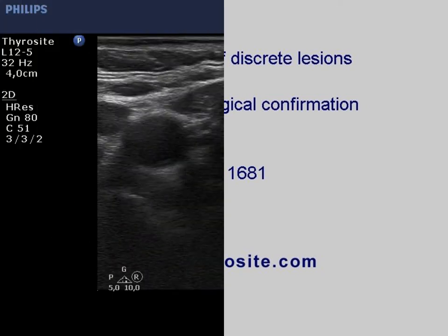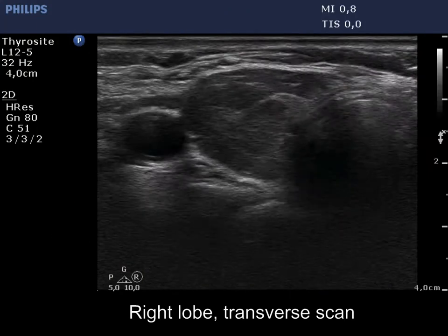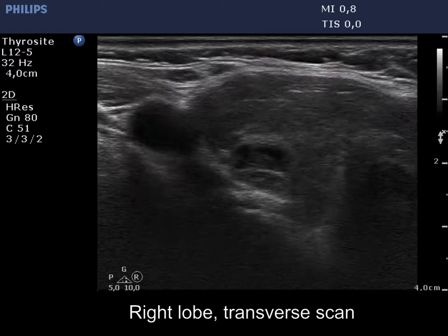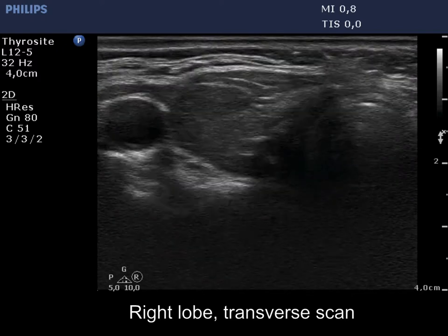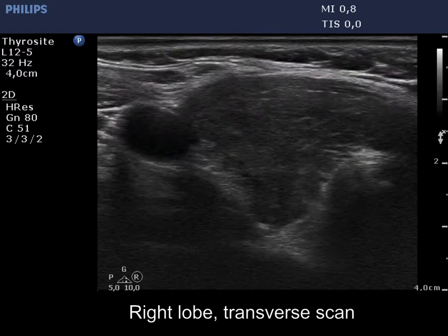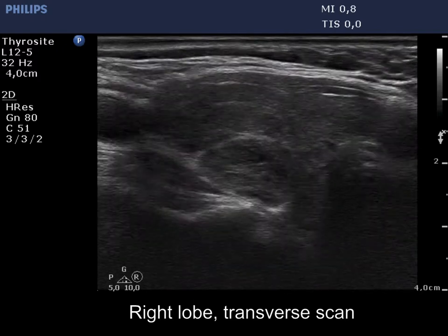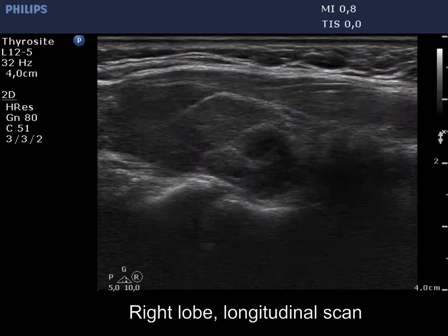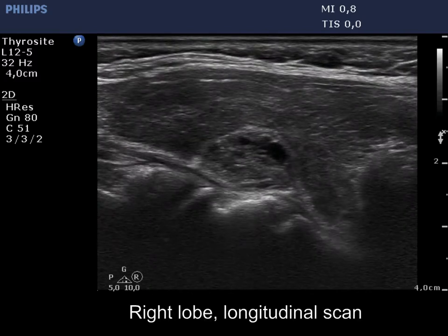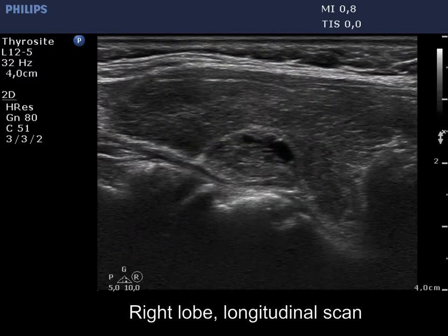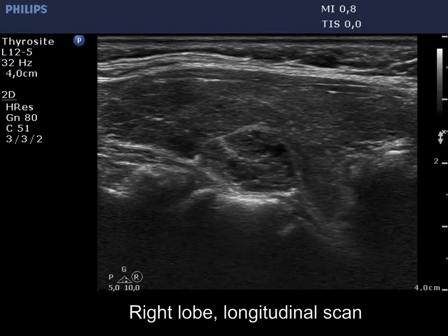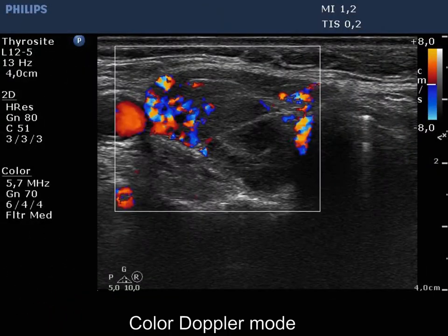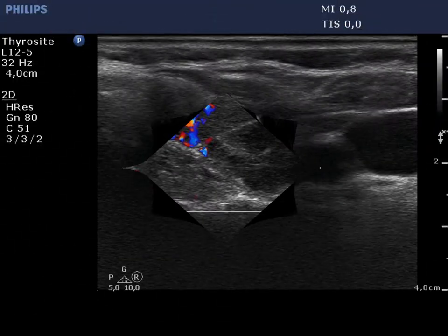The thyroid is hypoechoic, inhomogeneous, and enlarged. Connective tissue divides the lobe into smaller discrete areas. Except for a partly cystic lesion in the dorsal part, these areas are not pathological nodules. The vascularization is a bit increased.